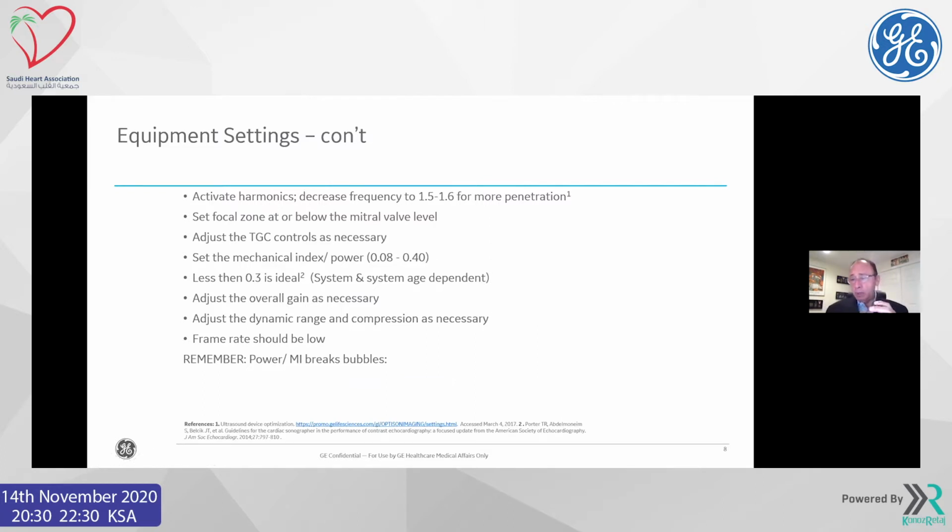In your software, there's 3 types of software that the manufacturers develop. We never know which one we're playing with. And in, I believe, the 2014 ASE consensus statement, they list the companies that are using types of software.